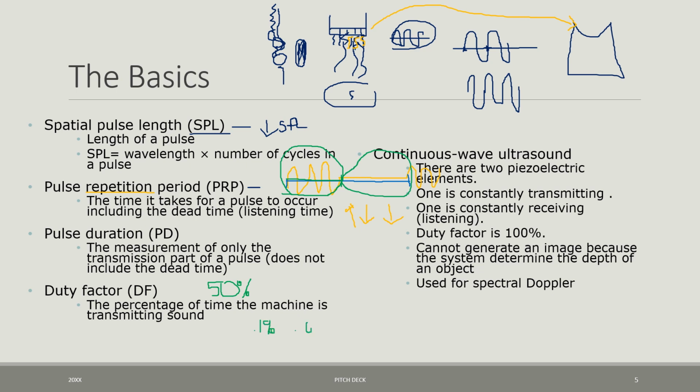Now, this is important to know. That means that while you have your transducer on your patient and you have your image unfrozen, that patient will only be receiving sound waves in their body 0.1% to 0.01% of the time.